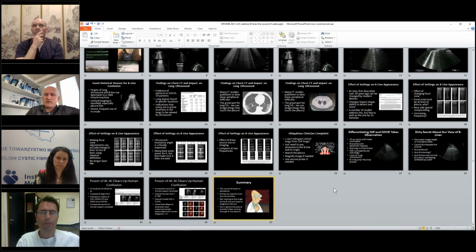So I would very much differentiate between the point of care, which a clinician should answer and should give the information into his decision making. And the more specific the question, for a certain otherwise diagnosed pulmonary nodule or whatever, it could be performed within a very specialized setting using contrast ultrasound, elastographic measurements, biopsy taken, and whatever. So it's a little bit of the entire range. Okay, thank you.